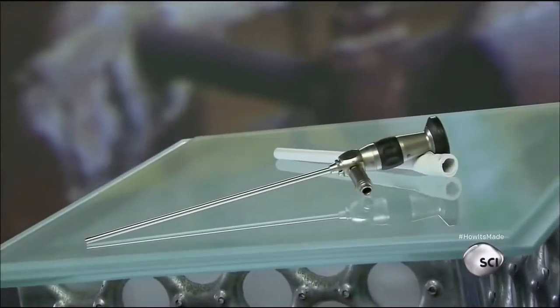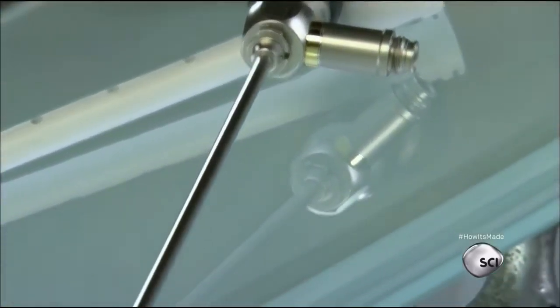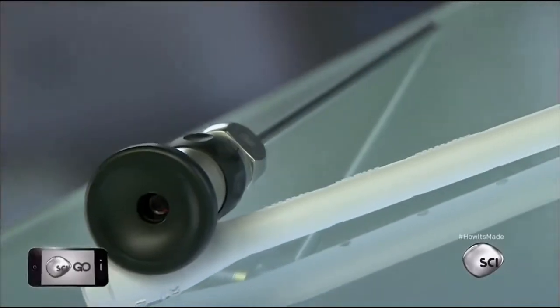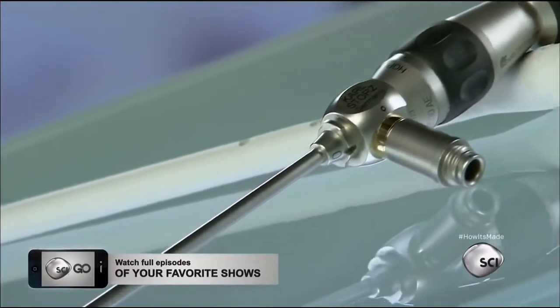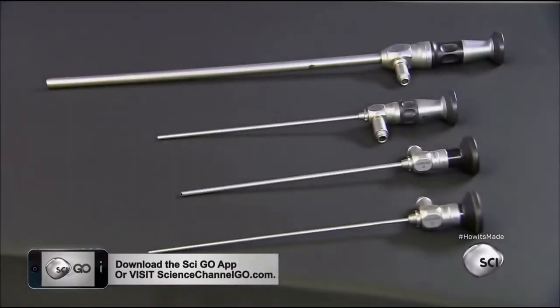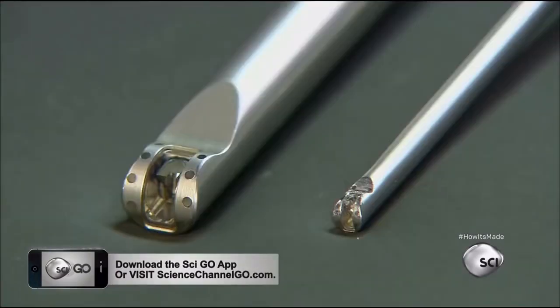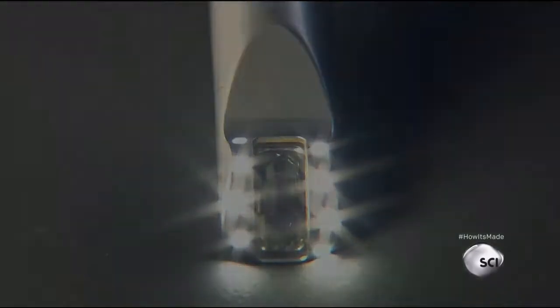An endoscope is a tube with optical glass fibers and lenses inside attached to a video camera. Doctors feed the endoscope through the patient's mouth or other opening, or insert it through a tiny incision. Then watch what the camera captures on a video monitor. An endoscope lets the surgeon see inside the patient during an examination or surgical procedure. Its light-transmitting optical fibers work like a flashlight inside the body.